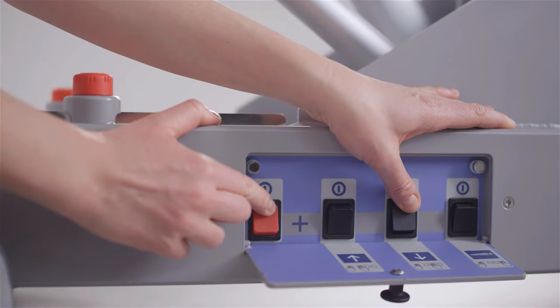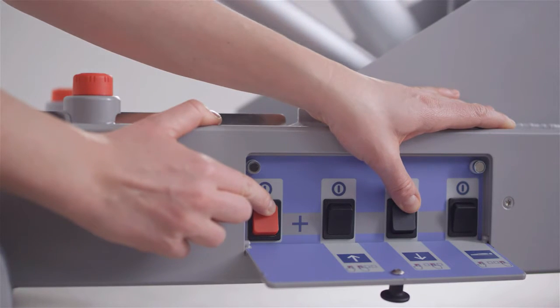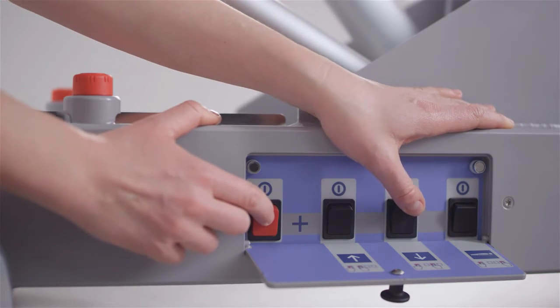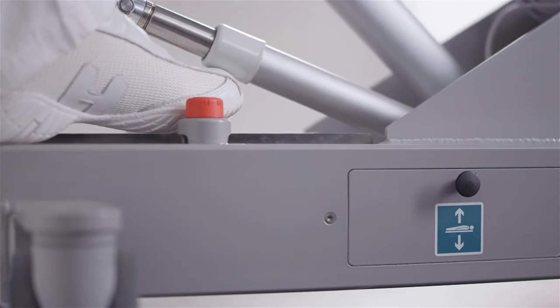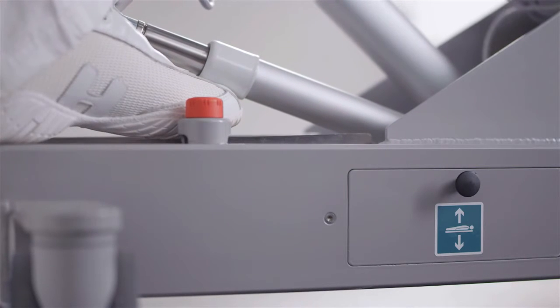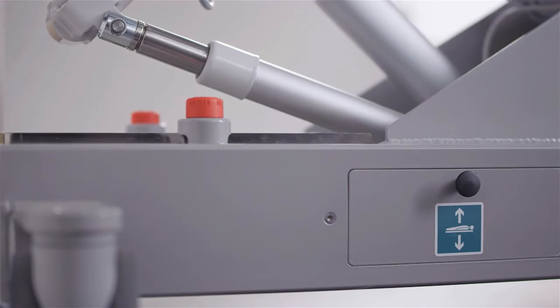Up to raise the stretcher or chair, down to lower the stretcher or chair, stretcher to change from chair to stretcher position. Remember that when emergency functions are used, the built-in pinch protection does not work. To avoid pinching, keep hands and feet away from moving parts when using emergency functions.